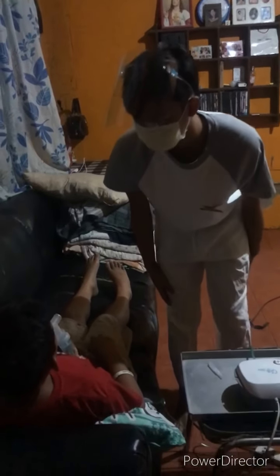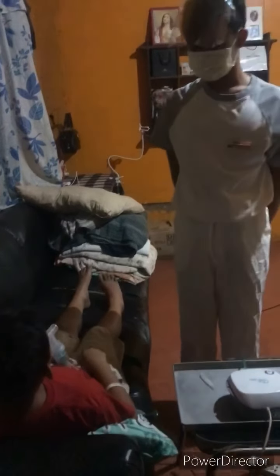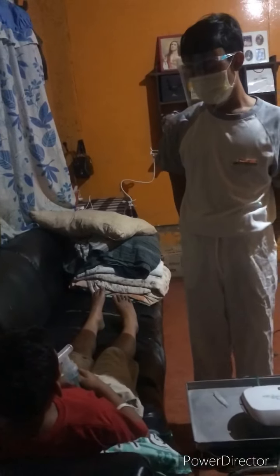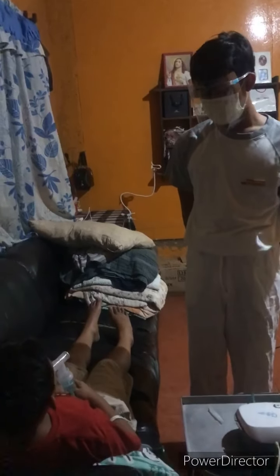Instruct the client to continue the treatment until he or she can no longer see a mist on exhalation. Lack of mist ensures that the client has inhaled the entire dose. Encourage the patient to expectorate, as the medication may help to loosen the bronchial secretions.